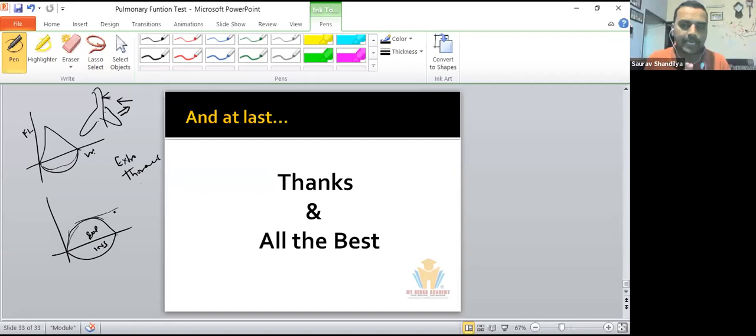Okay, so upper airway obstruction will definitely create a problem even in this case. In the flow volume loop, if it is an intrathoracic problem rather than extrathoracic, definitely this will also go down and this part will also come down. So there won't be any PEFR actually in intrathoracic upper airway obstruction. It won't happen. Did you get my point, what I'm saying? It won't happen because, you see, if there is upper airway obstruction, how will the PEFR be attained? It cannot come into reality. It is not possible to bring it into reality.